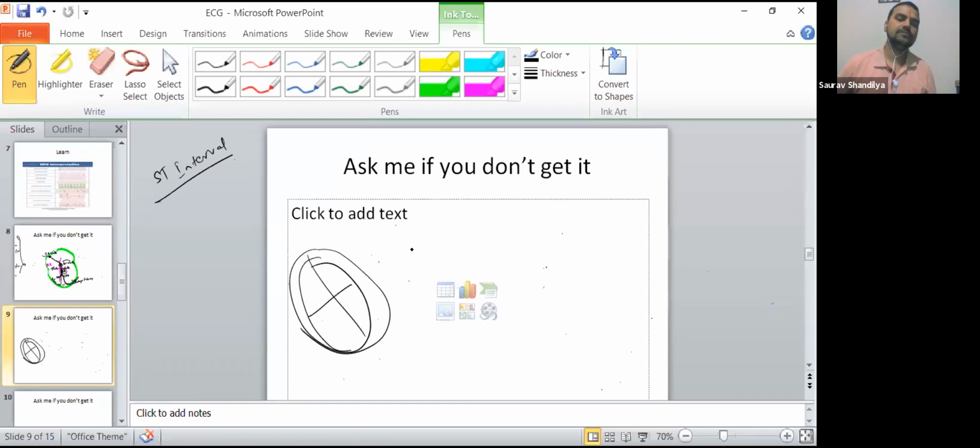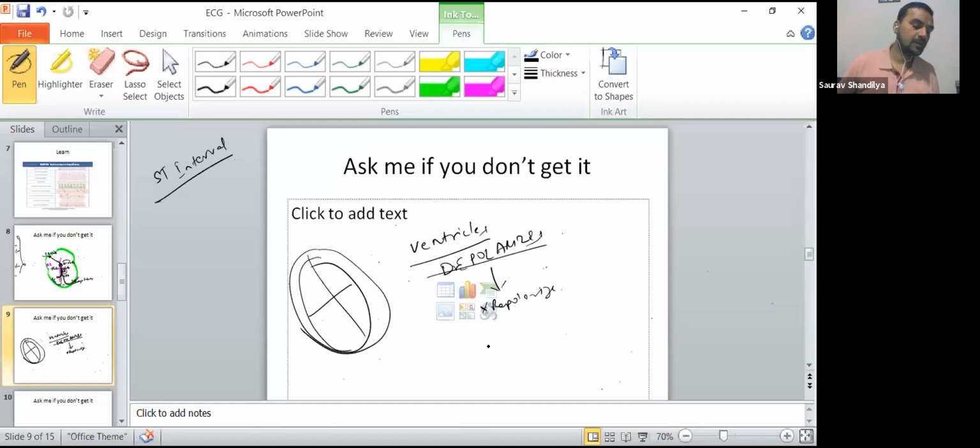Okay, now you have mastered over this, right? So entire ventricle is depolarized, means all are set, right? Now what happened? But it has no repolarization still. Okay, so there is no potential, right? So there is no potential for some time. That is the reason isoelectric line keeping silent after the S wave come into picture.